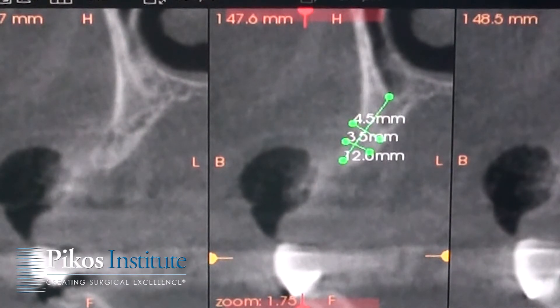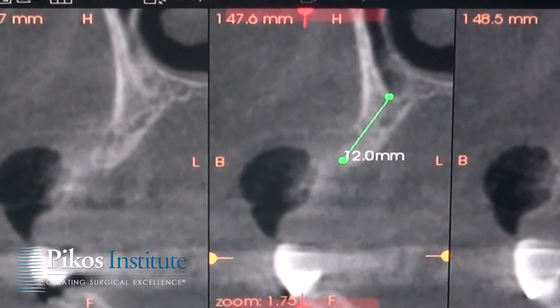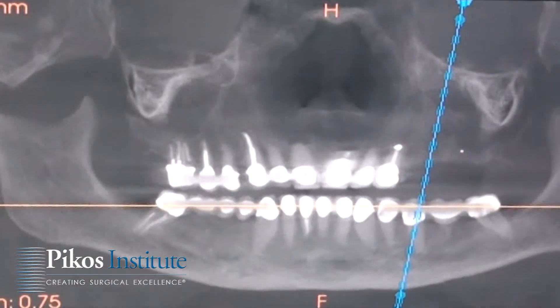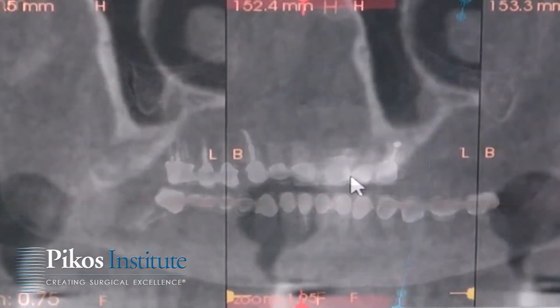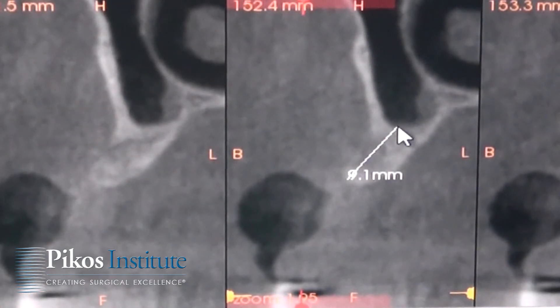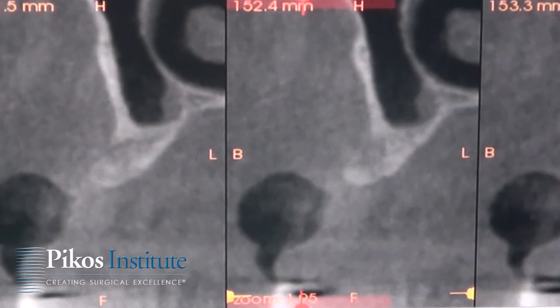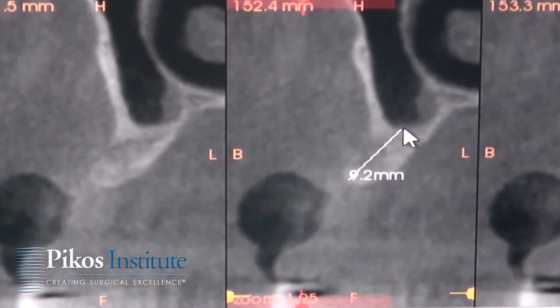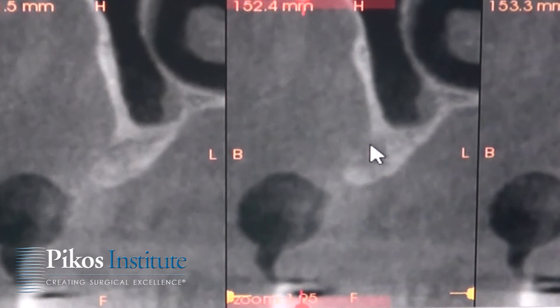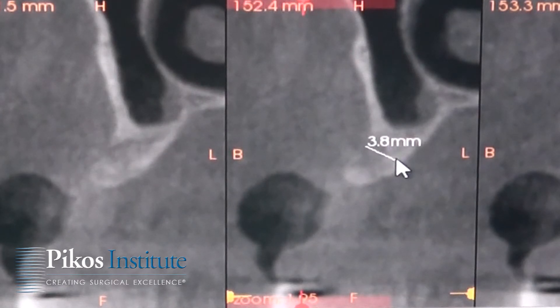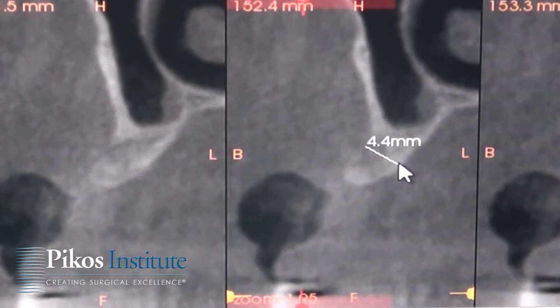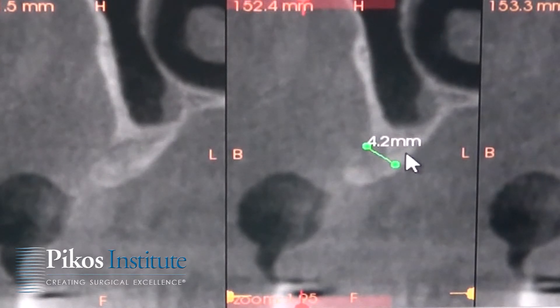Moving along, if we look at the number 13 site, the second bicuspid area, this ridge appears height-wise to be not quite as long — maybe 9, 9-plus millimeters going that direction. Still about 9-ish. And if we then look at the width here, this looks a little bit lucent, but probably about the same — 4.2 millimeters.